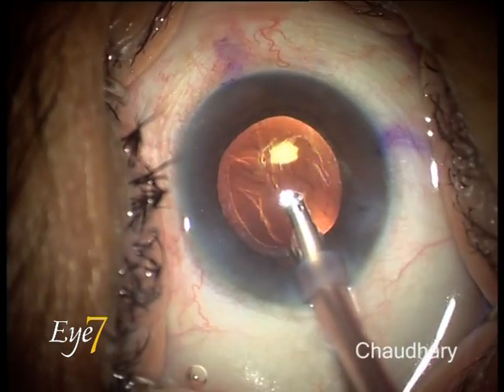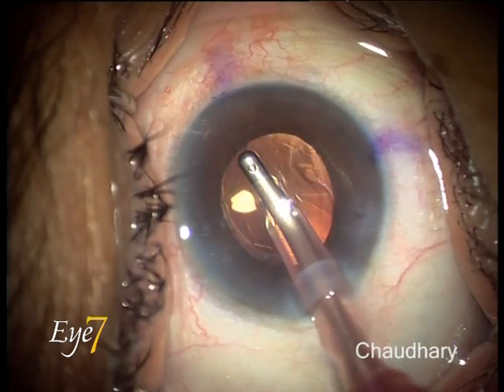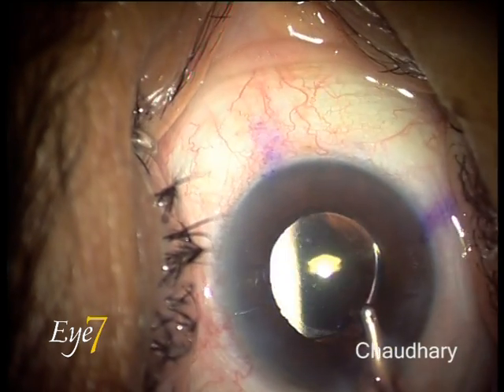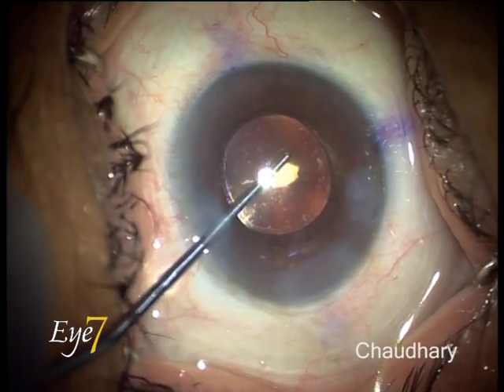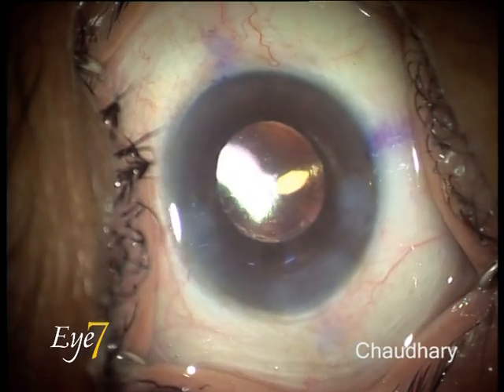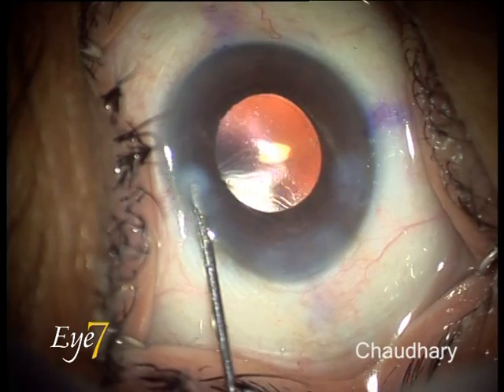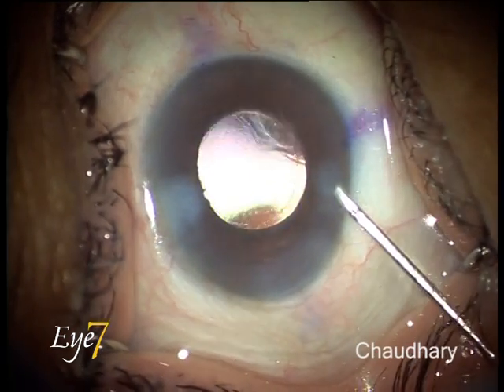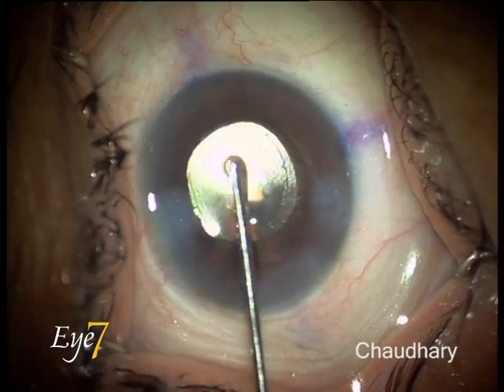With the IA system, I am removing the viscoelastic from over the lens and then from under the lens. With the probe, I am fine-tuning the lens into the right position. I hydrate the wound edges and increase the anterior chamber pressure slightly above normal so that the lens does not rotate further. On seeing this patient in the OPD after 15 days, she just had a 0.25 residual cylinder.